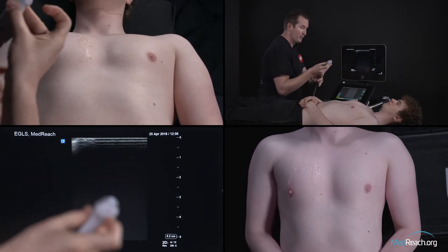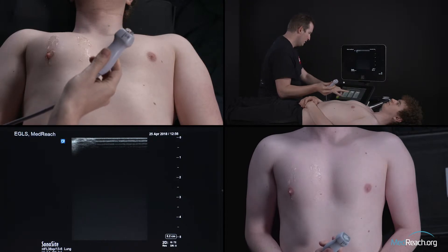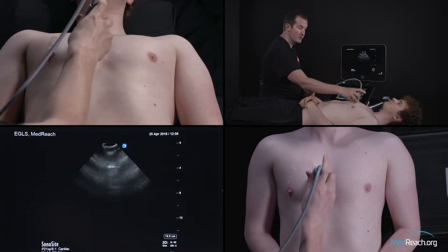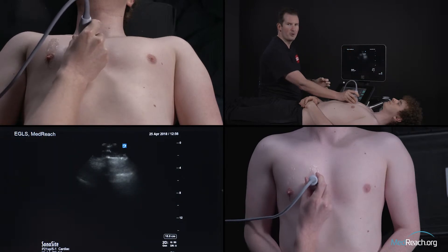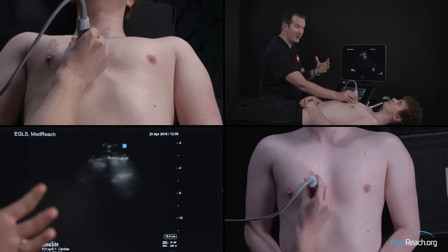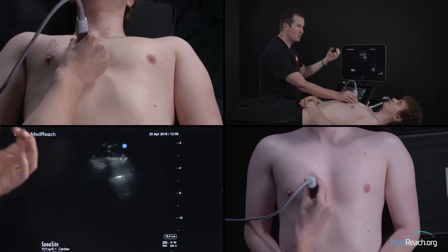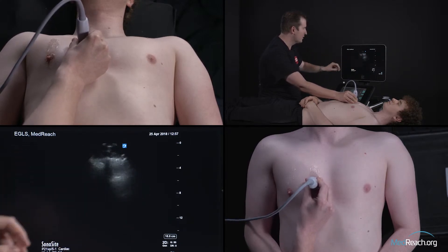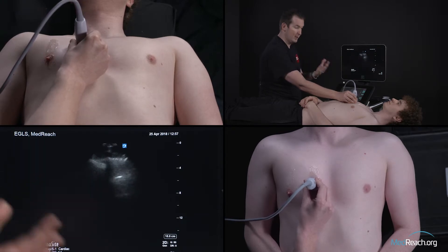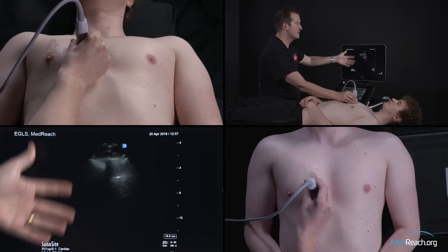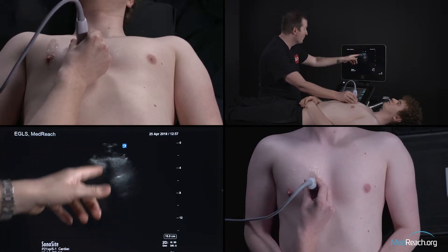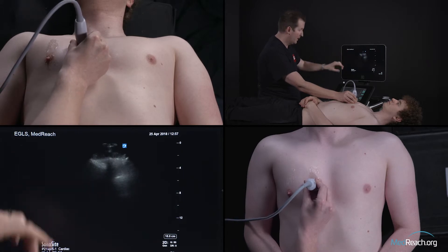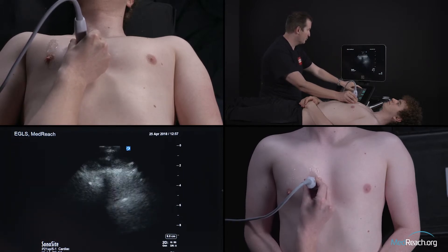Let's change right now to the phased array probe. I'll change that on the system. Now put it back on the chest so we have an image on the screen. Immediately, we see it's harder. At first I was really frustrated using the cardiac phased array probe because the image is coarser — it's not as high resolution, and you don't see the ribs as well. My thought process whenever I use a low-frequency probe is to just look at the screen. I don't see any B-lines. If there were B-lines, I would see them — those vertical artifacts going from the pleural line downward, white, echogenic, moving with the pleura, well-defined.